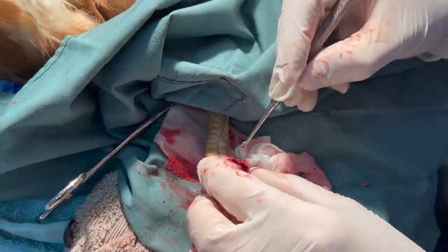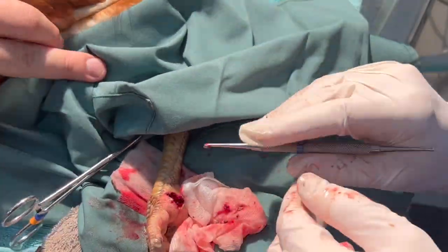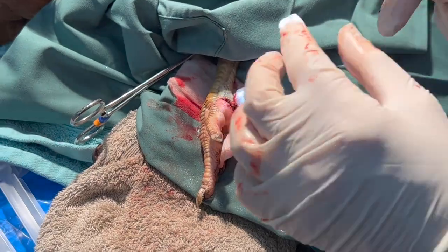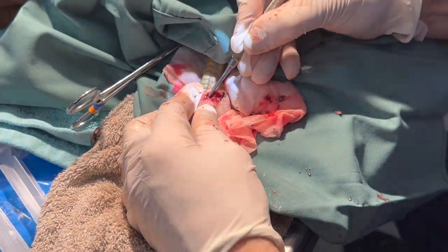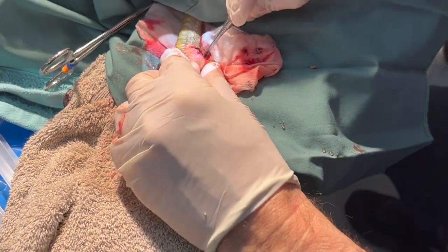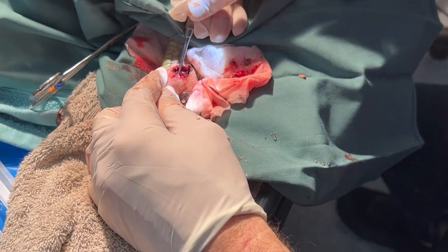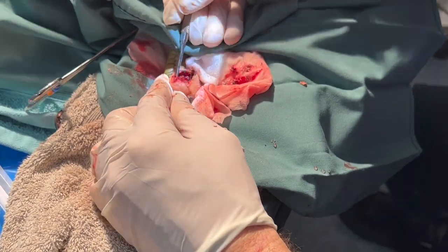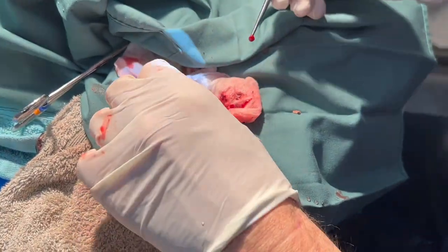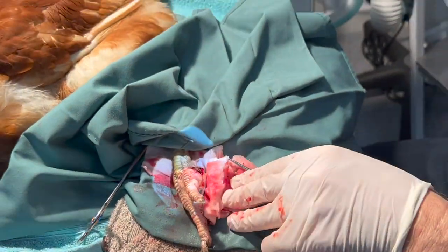This is what bird pus is like — this is as pussy as a bird's foot is going to get. The smell is really quite horrible. It leaves quite a hole, so the plan now is to close it — we're going to stitch it closed, put some antibiotics into the wound, and hope the body heals it now that it's relatively clean.